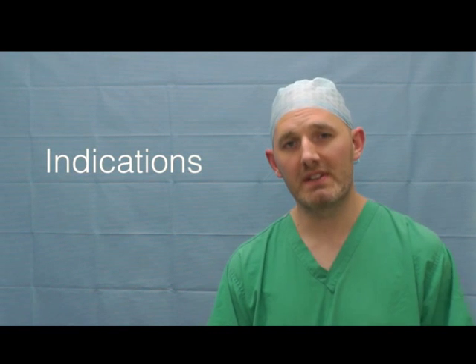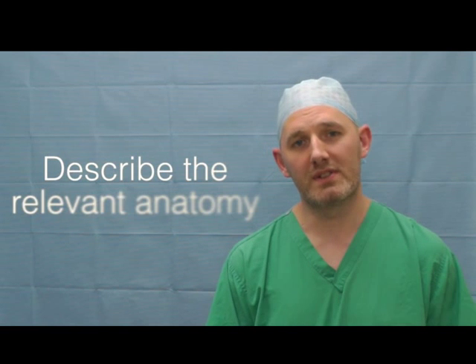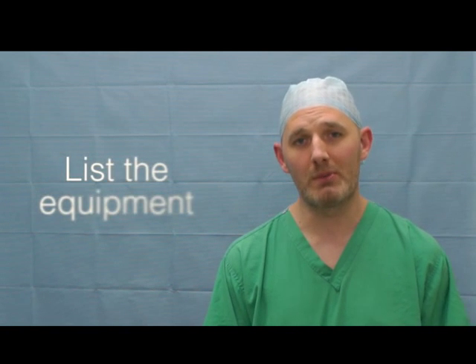Okay, so now it's your turn. We've got the bench trainer here for you to have a go on. And in summary, we have described the indications for performing a surgical cricothyroidotomy. We've described the relevant anatomy, listed the equipment you need, and finally we've demonstrated it on a bench model. As a guide, you should be aiming to do this procedure in under 40 seconds, and really you need to be practicing this every 6 months to keep your skills up.